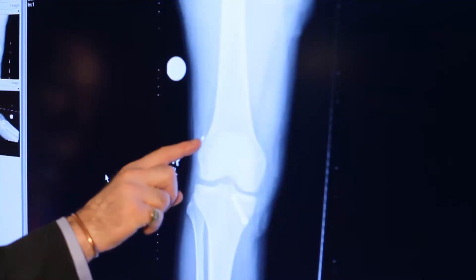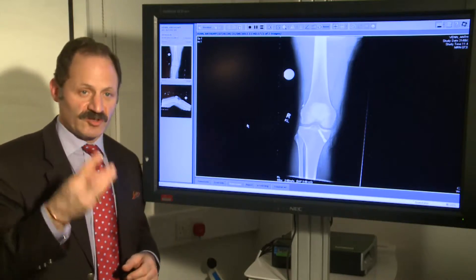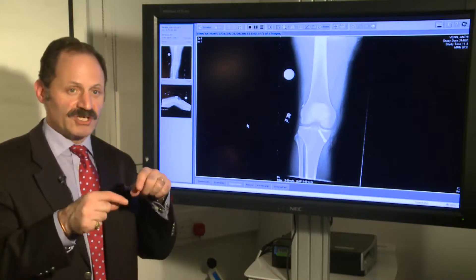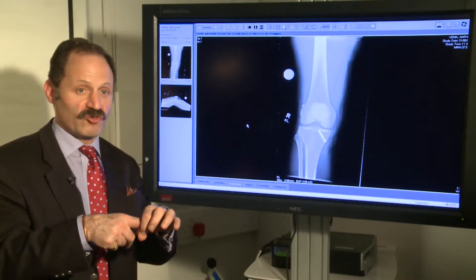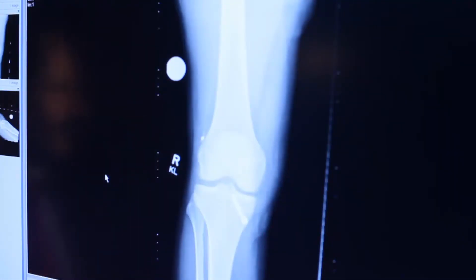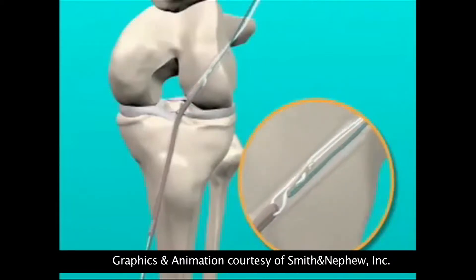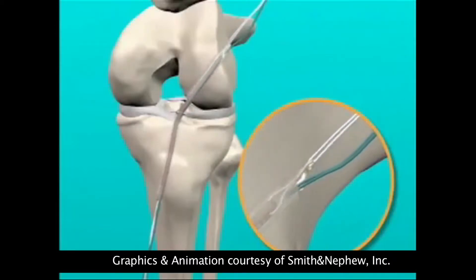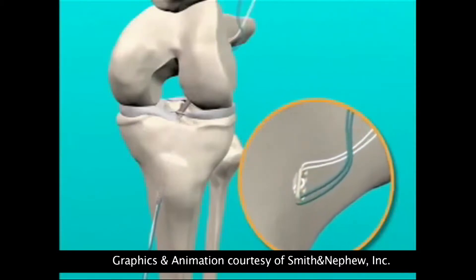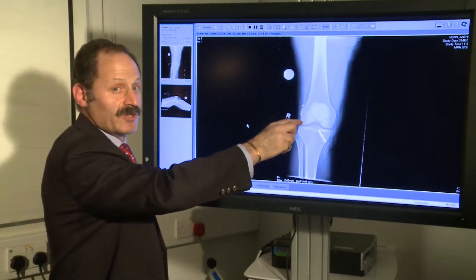You can see a little metal button here. For the graft, we take two of the tendons and double them over so you have four strands, and they are then put over a loop of very, very strong Kevlar suture that is around a little metal button. A little pilot hole is drilled through and we literally pull those up into the tunnel, flip the little button on the top, and pull it back so it's now nice and strong — fixed in the thigh bone tunnel, in the femoral tunnel.